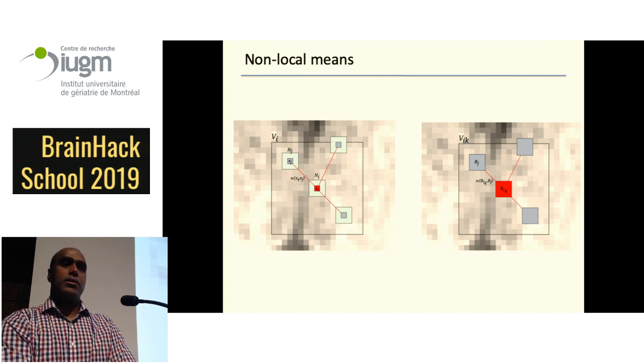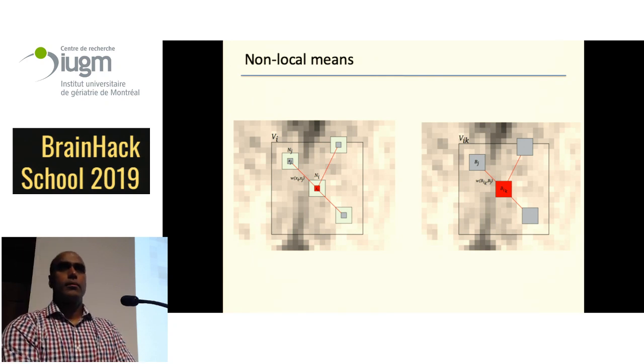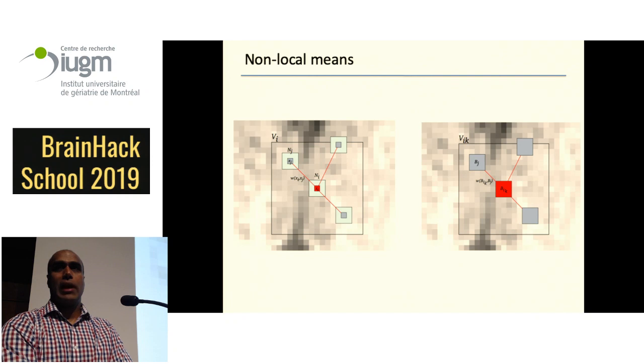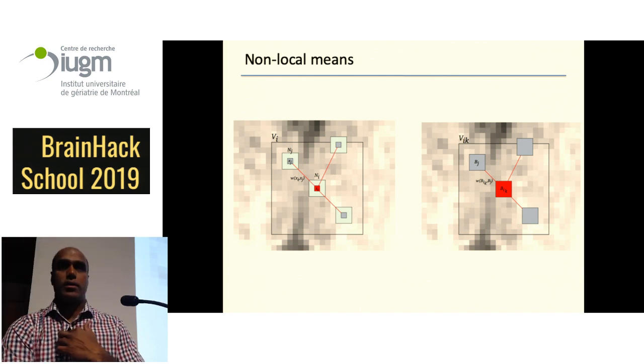Maybe for the audience, some of the steps you've seen here now have deep learning algorithms that do them well. Brain registration, for example, has state-of-the-art performance on some data sets, and it's also extremely fast. It's really exciting: you can do a brain segmentation in under a second on your laptop, which means you can do it 100 times with a little bit of noise to see how robust it is, which is something we cannot afford with current tools because they're so slow. I'm personally very excited for the next generation of image processing, which would run in a few minutes instead of a few hours.